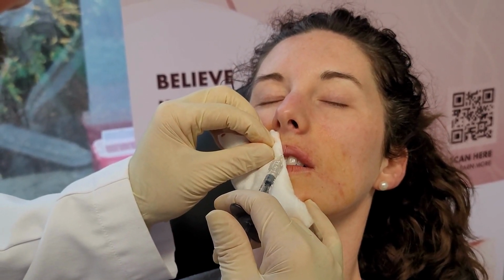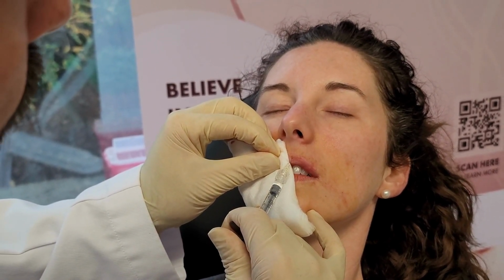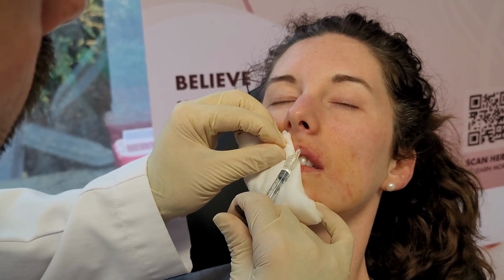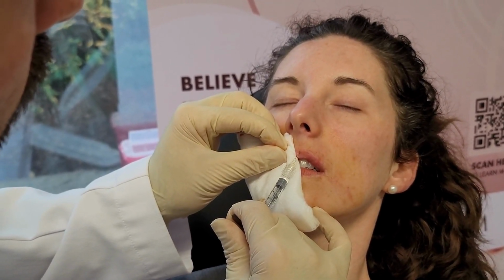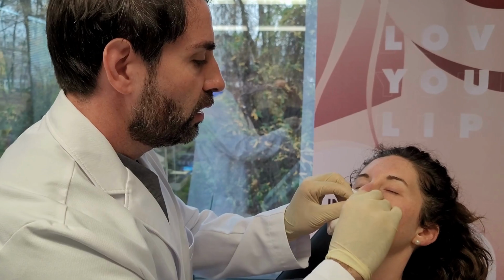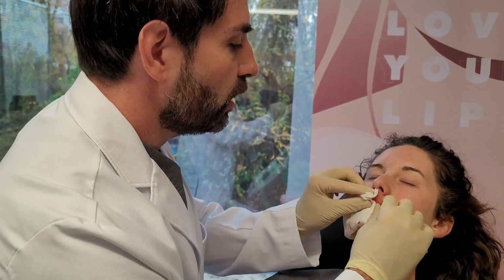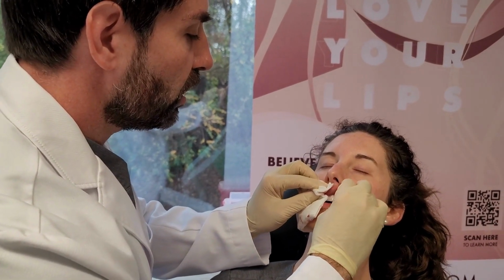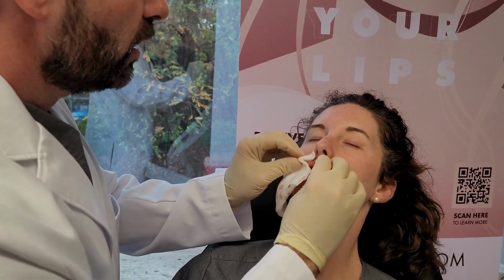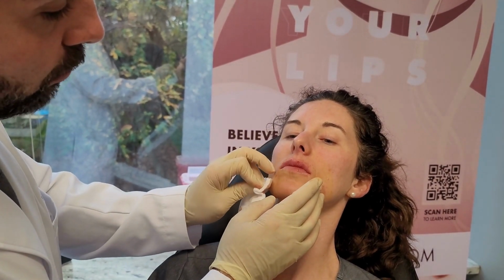Do this side now, and 1, 2, 3. This is a superficial injection, very much into the dermis. That's it. After the product is injected, we gently massage it into the lip, spread it about. Injecting it smoothly is important, but any small lumps will be massaged away into neighboring areas to spread the product evenly. Okay, now we'll take before and afters and show. Close your lips. Okay, so now we've done the upper lip.